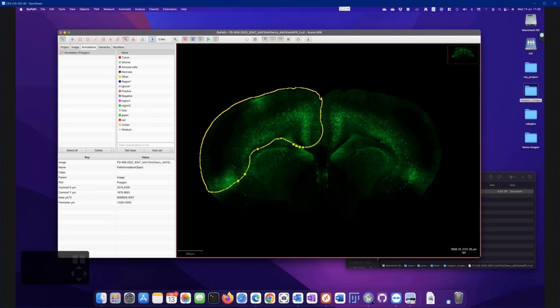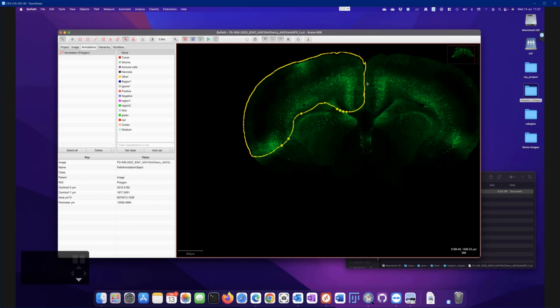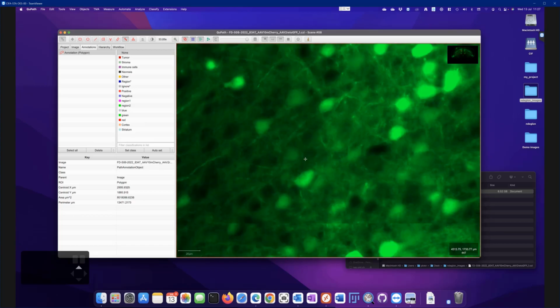Come on. And let's just remove those parts here. So I can also use the wand to expand, but it's a bit harsh because here it's probably too zoomed in. Yeah, something like this should do the trick.